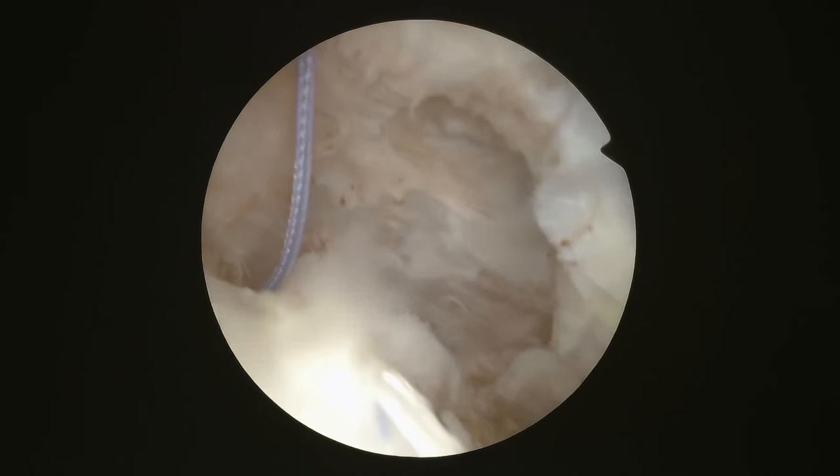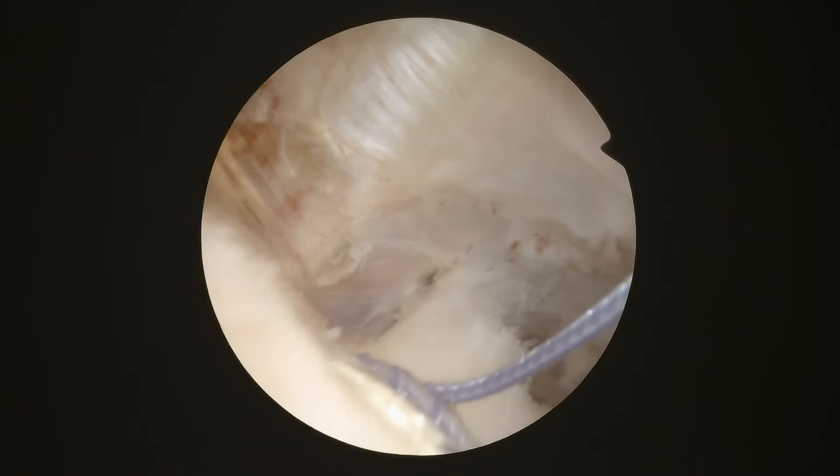So that was one anchor, and this is the second anchor. You can see the suture laying on top of the rotator cuff, pushing it down to the bone where we're trying to get it to heal.